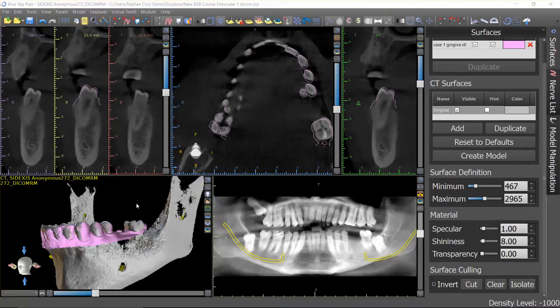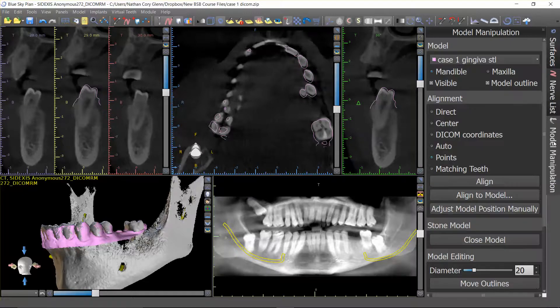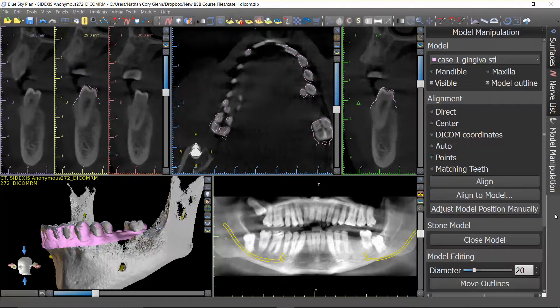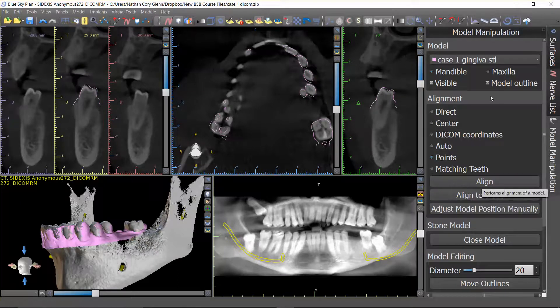Now that the jaw is isolated we're ready to go ahead and re-stitch the STL. Right now we're in the surfaces panel; we need to go back to model manipulation, which is the panel we'll do all of our stitching from. Rather than matching teeth, which is what we did last time, we want to do the points method of aligning. Click points and make sure you have it on the correct STL.